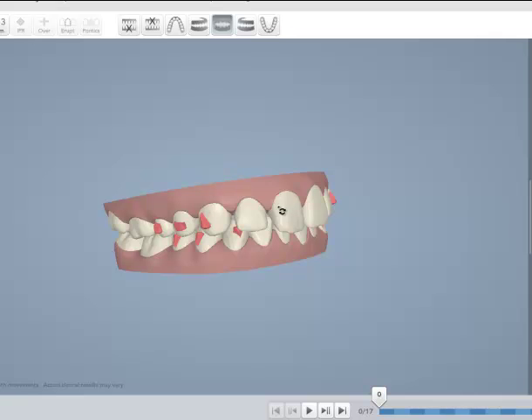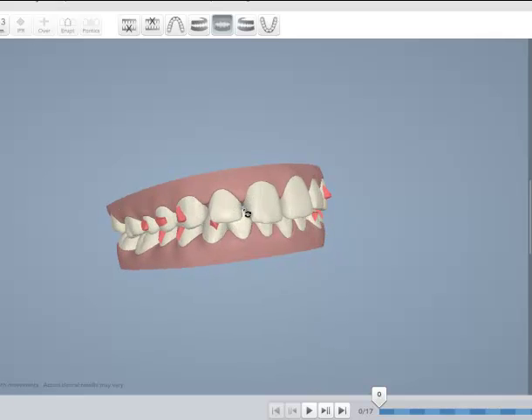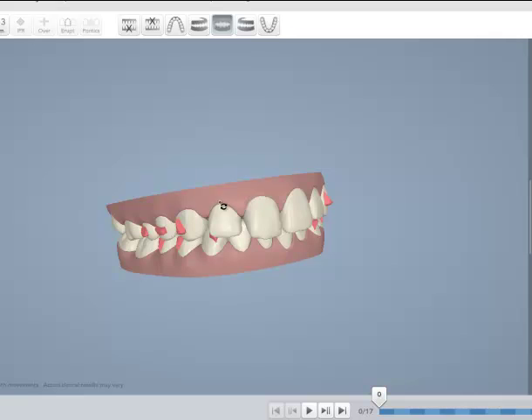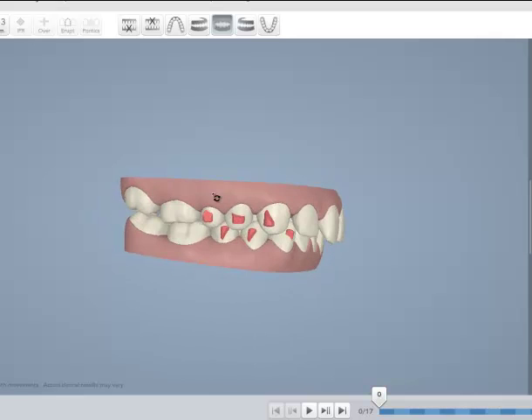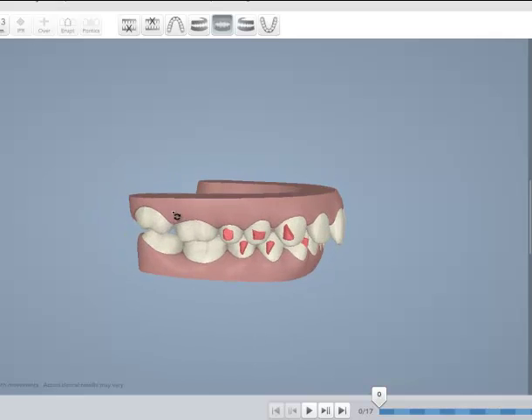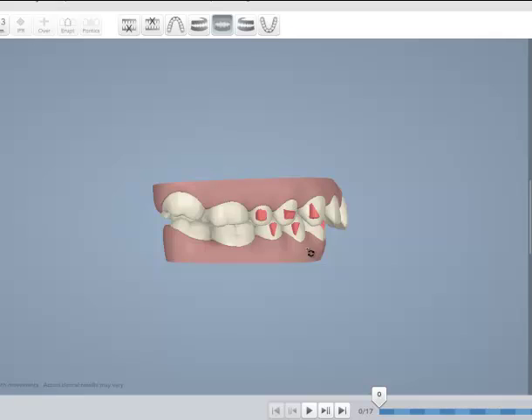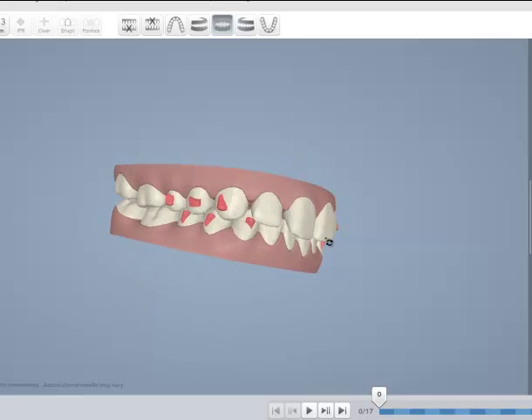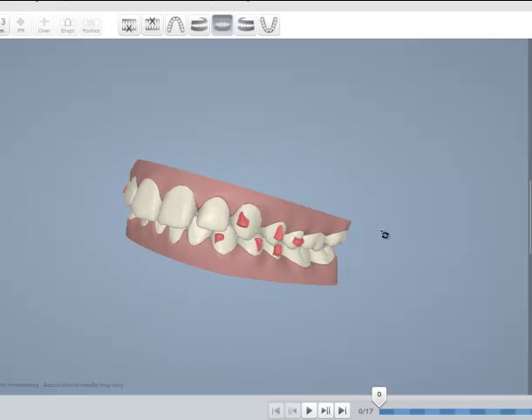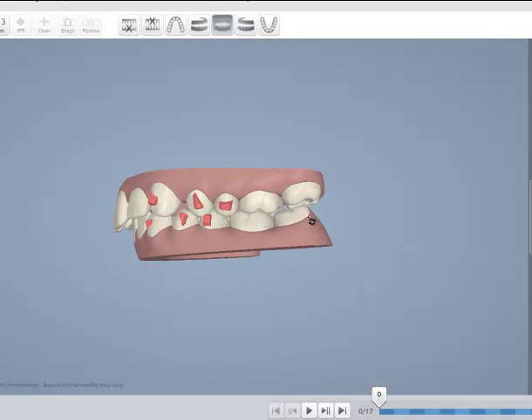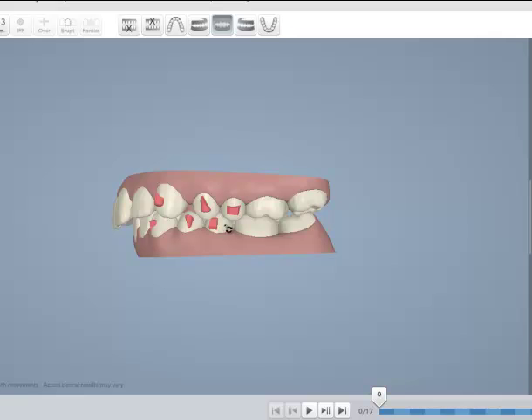As you can see, this tooth is not torqued properly, but the patient is Class 1, orthognathic, has a good lower arch, both sides are Class 1 with good intercuspation.